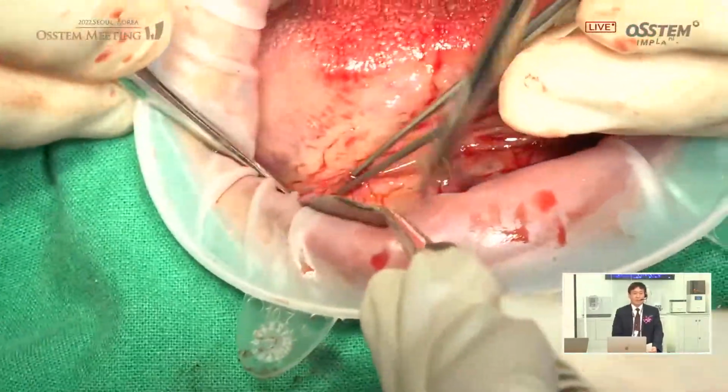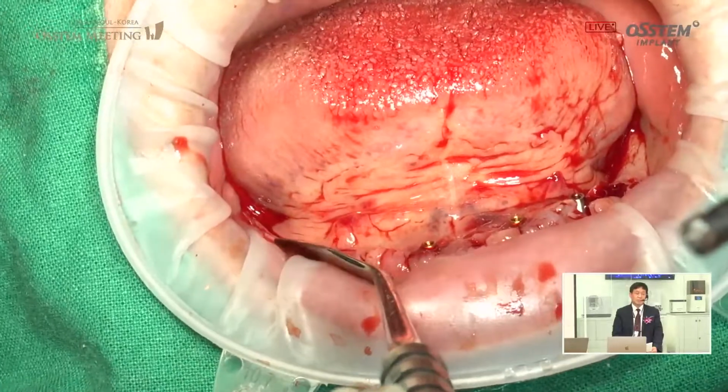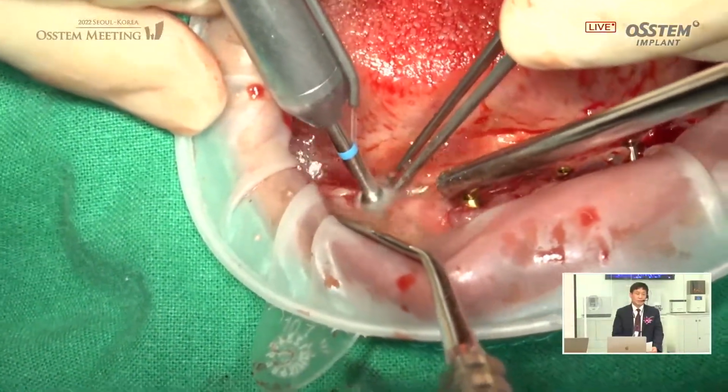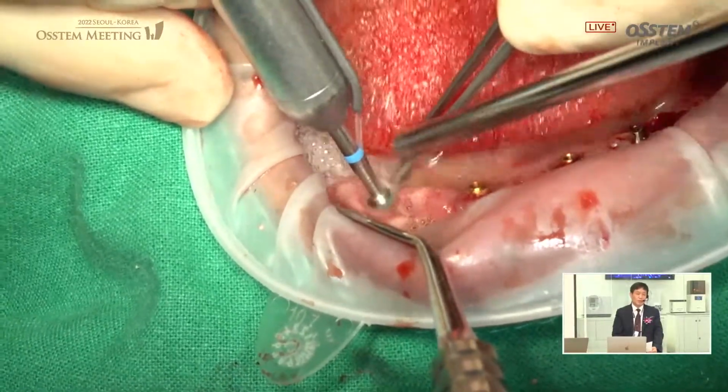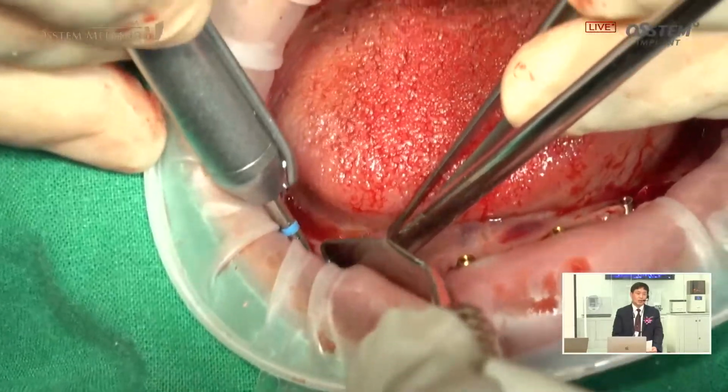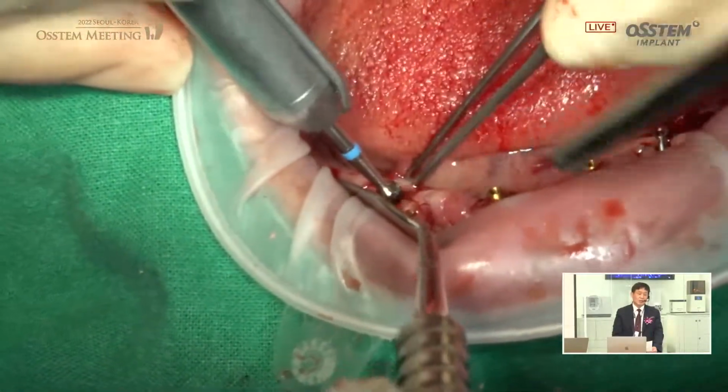Suction. Please hold. Distal to the placed implant, it is being prepped. Suction, please.